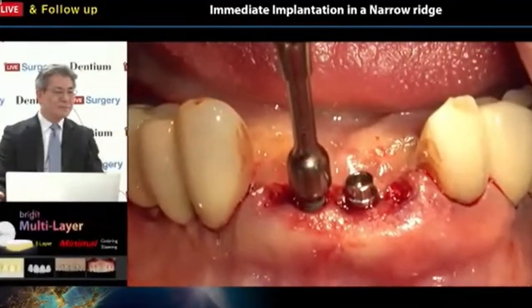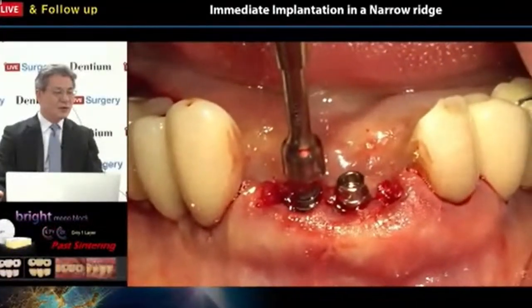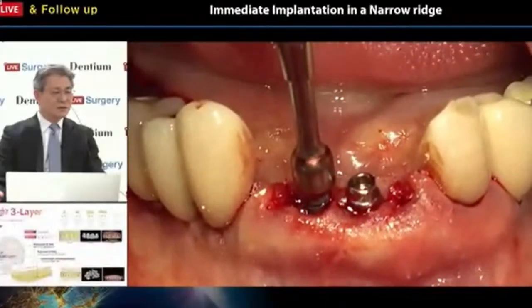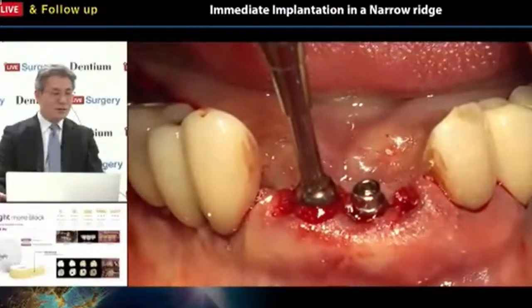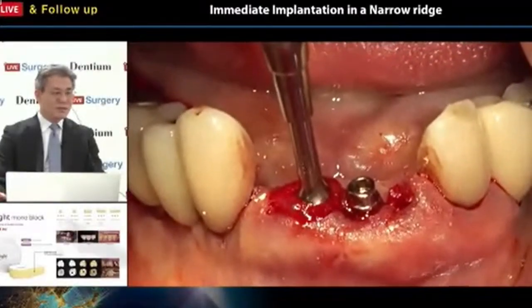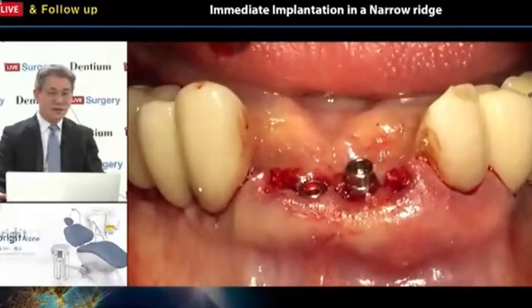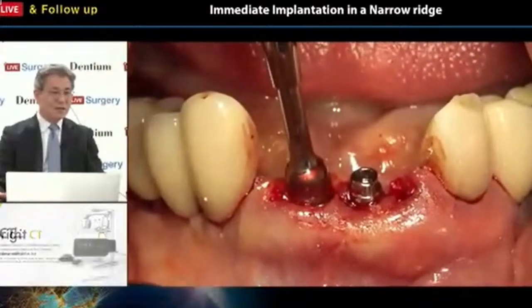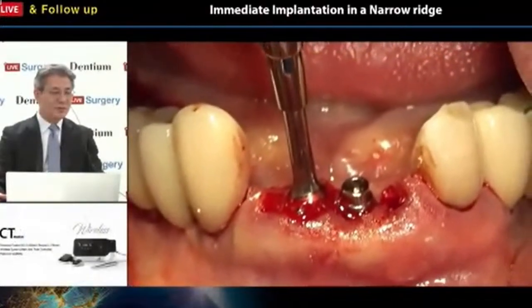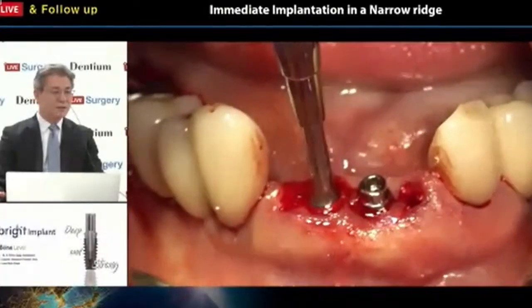like a dual abutment. If you want a longer one, then you can put the longer scan abutment. So the longer one works as a temporary abutment, and also sometimes as a final abutment, like a dual abutment of the Superline implantium system.